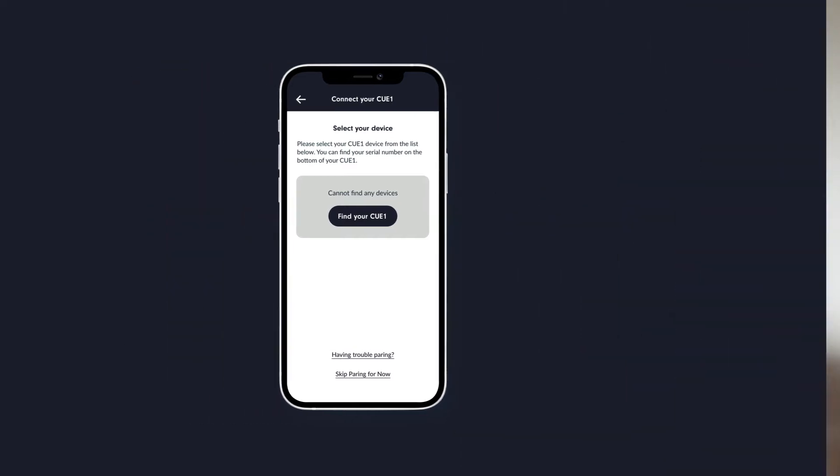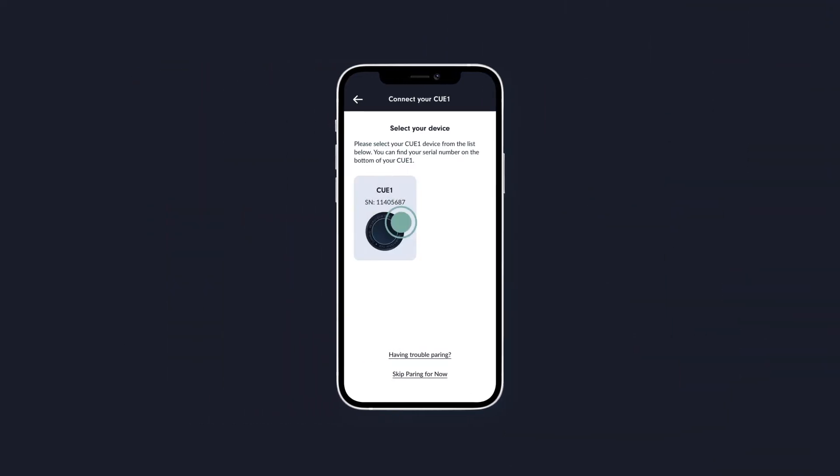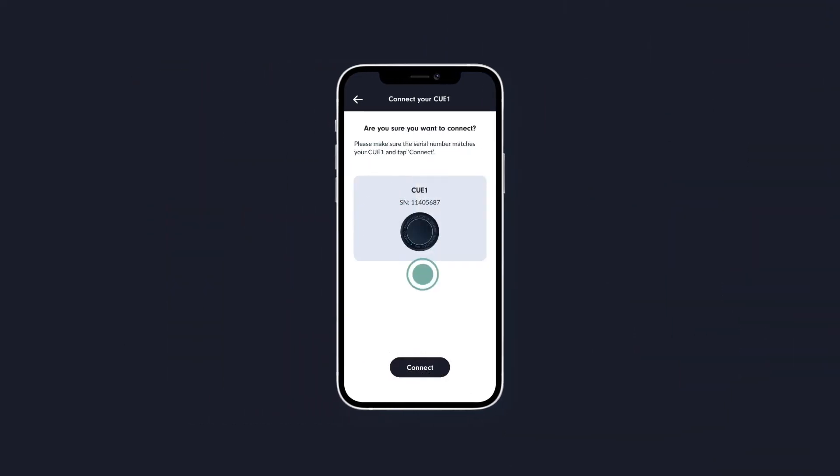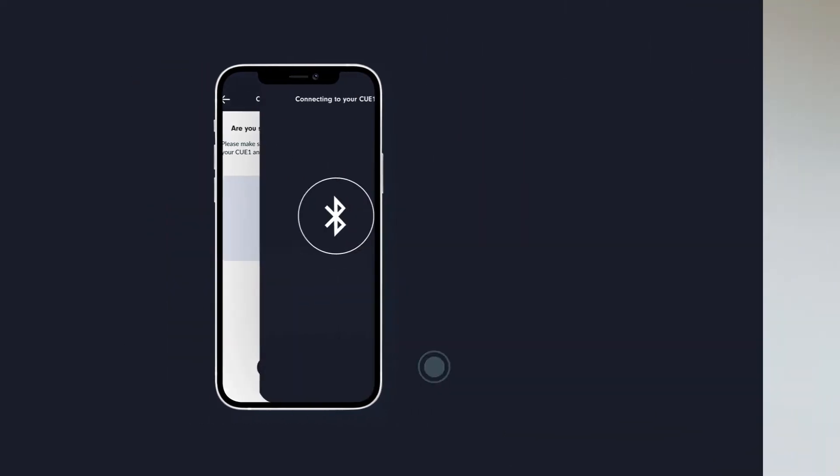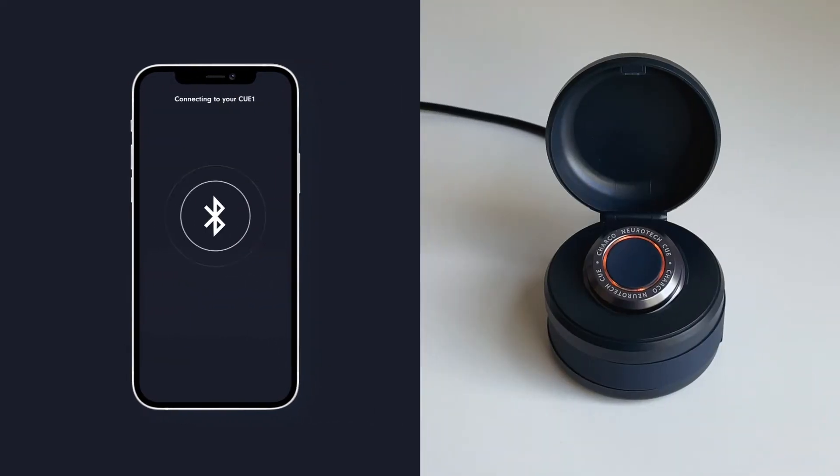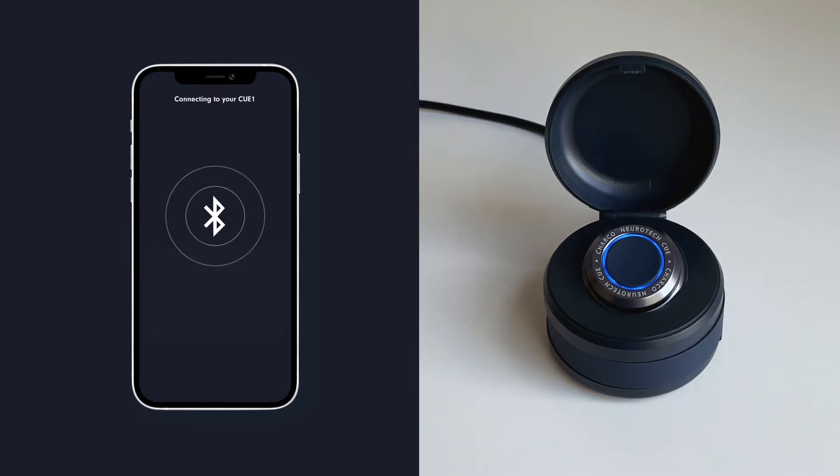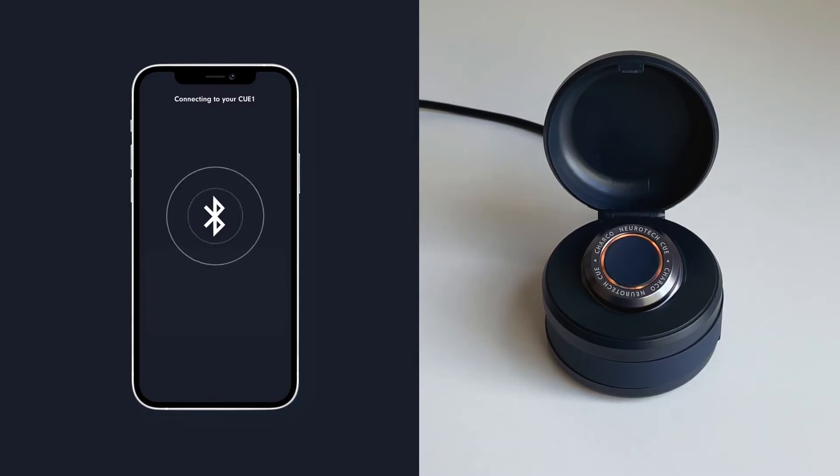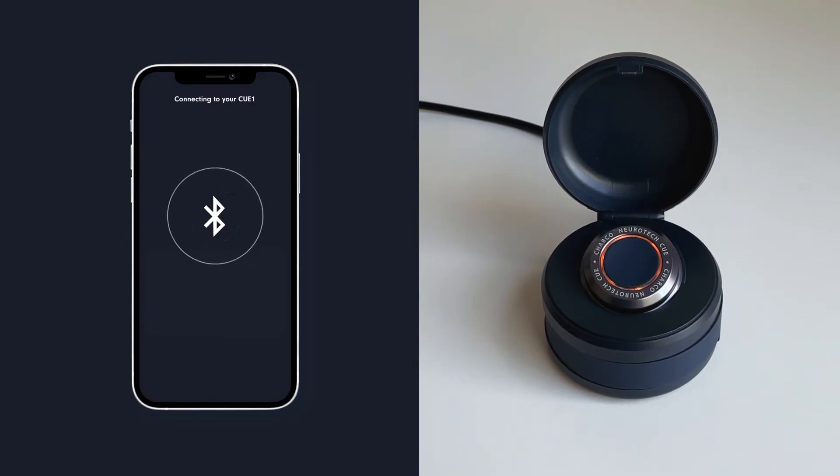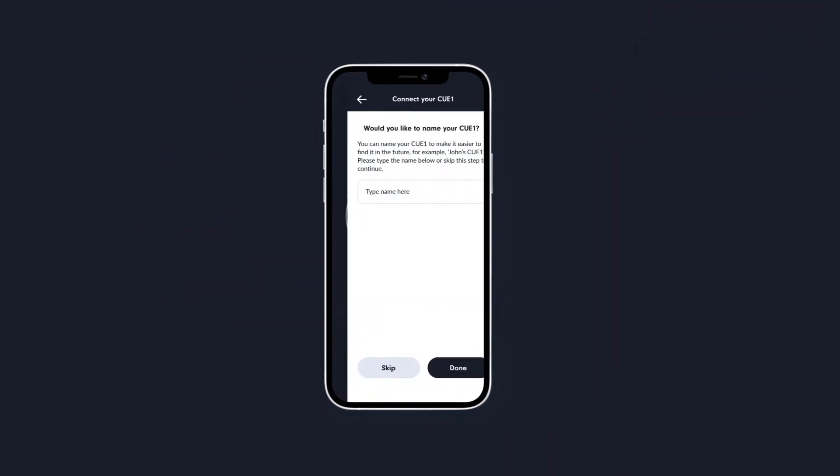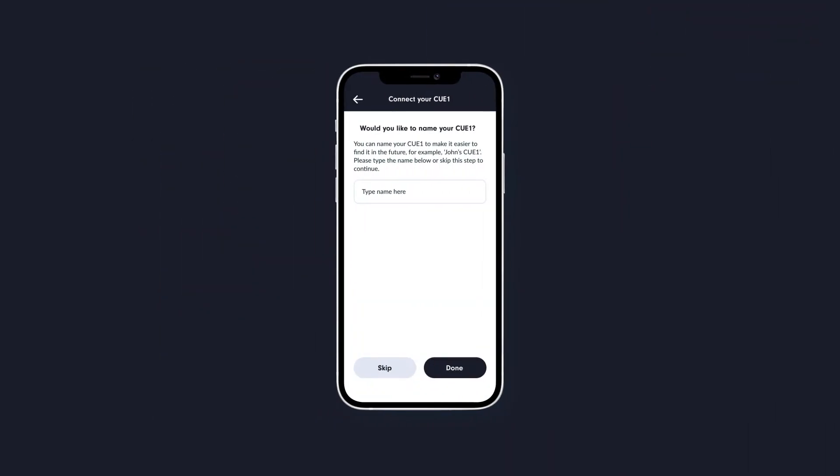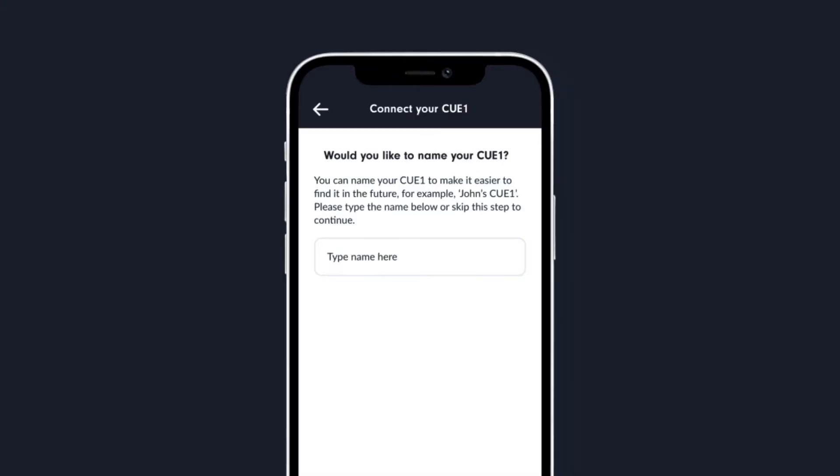Once the app has found your device, please tap on it to connect. This should result in a short spinning blue light animation on the Q1 device. You will then be able to rename your Q1 to make it easier to identify in your app for the future.